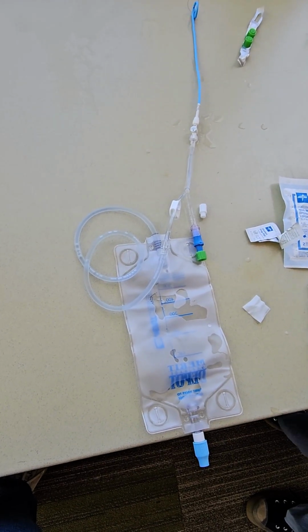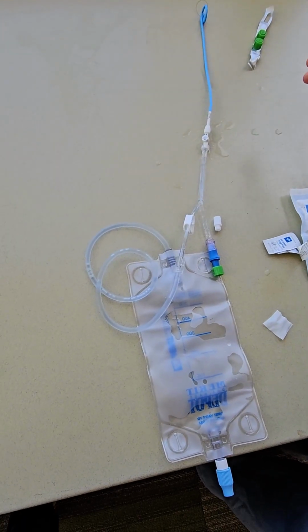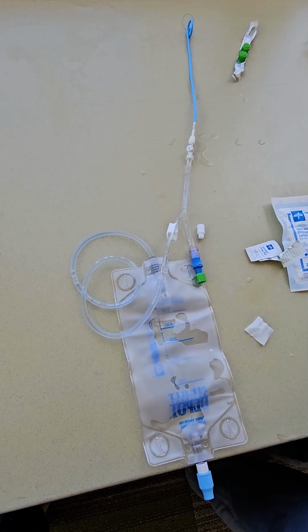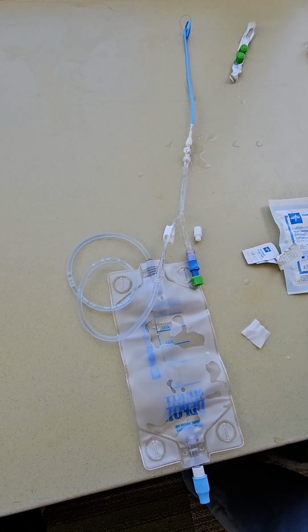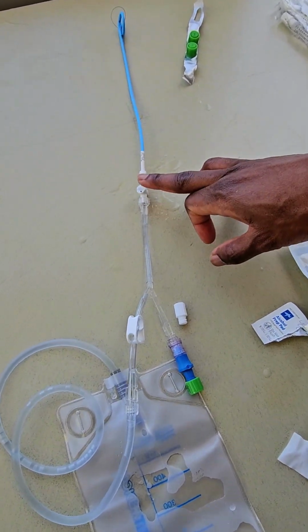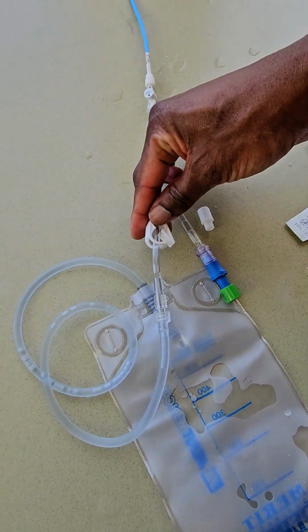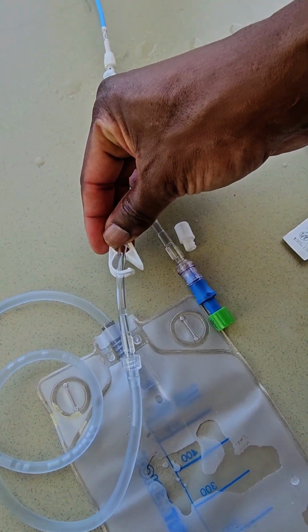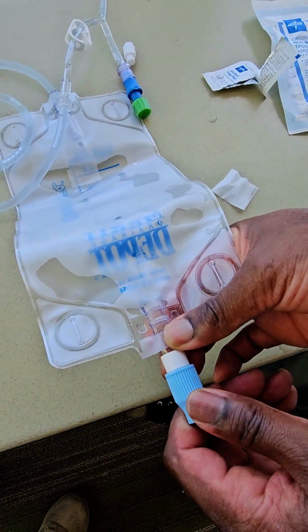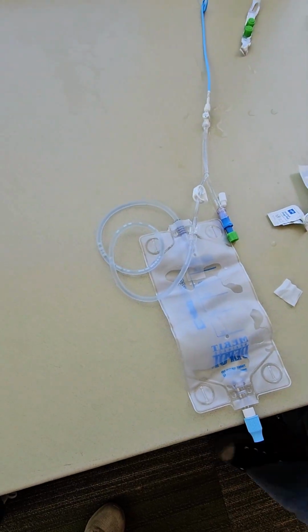So some of the troubleshooting things, like I said, is making sure that the drain is not kinked, or looking to see the possibility that the drain is kinked. Sometimes what we'll do is we'll ask for imaging, perhaps a KUB, because we can actually see that the drain may be kinked on a KUB. We can also see whether it's in a different position. Also looking at the connections here between the Y connector and the drain, and between the bag and the drain, and making sure that those are tight and there's no leakage, making sure the clamp is actually open and not clamped. And then one last thing that's nice for the patient is also looking at the end of the bag where the screw system is to make sure that everything is tight and that there is no leakage.